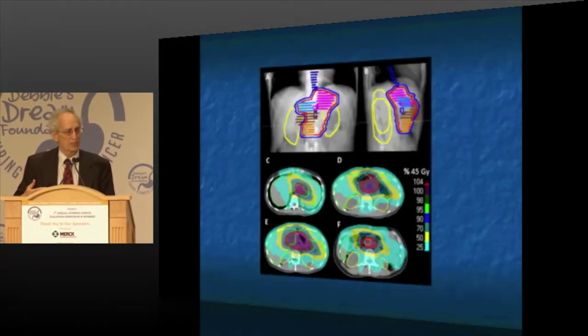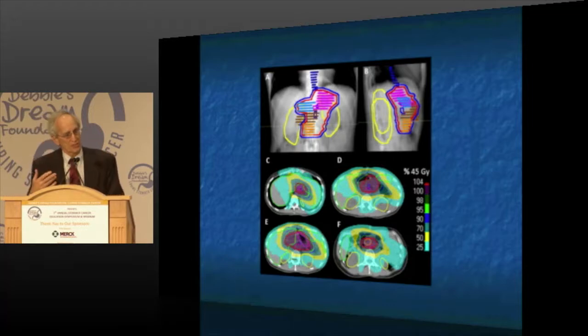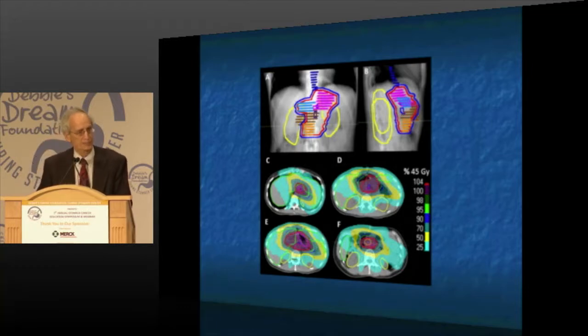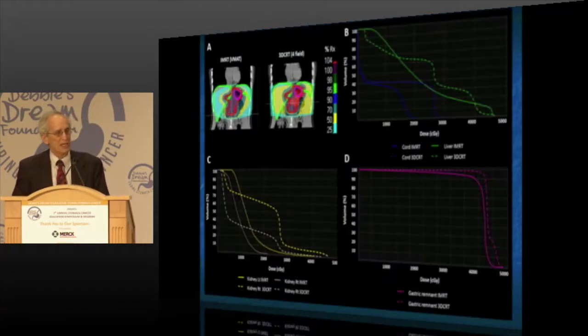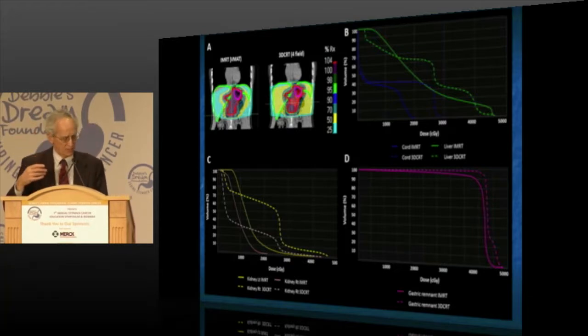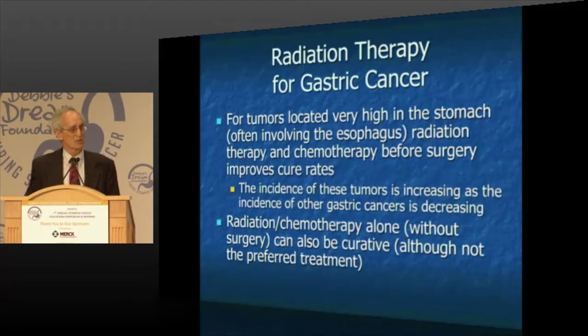whether those remain within acceptable limits. This is a tumor of a somewhat different location, and the technique is now a little more complicated. The radiation beam is coming in from more directions, but the whole idea is still to get the radiation dose to conform to what we wish to treat. And each patient is individual. It's not the same volume for each patient that we treat. And you come up with these different curves, these dose-volume histogram curves, and different approaches that I won't go into more, both in the interest of time, and I don't think there's any need to do it.